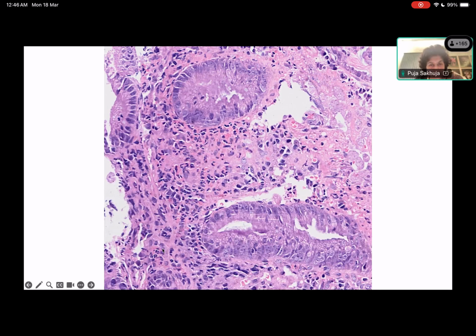Okay, now coming back to this biopsy. What are we seeing in this region? Mansi, what are we seeing in this focus? Can you describe what we are seeing in this slide currently on your screen? Inflammatory cells are seen. Stroma shows inflammation, ulceration. What type of inflammatory cells are these? That's a very loosely worded sentence. Macrophages can be seen. Or what else? Which are the macrophages?